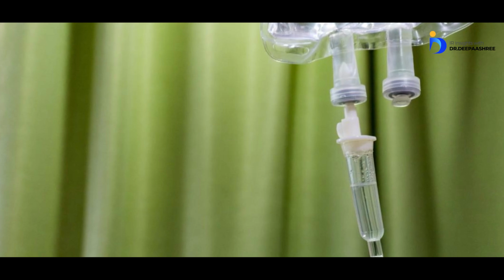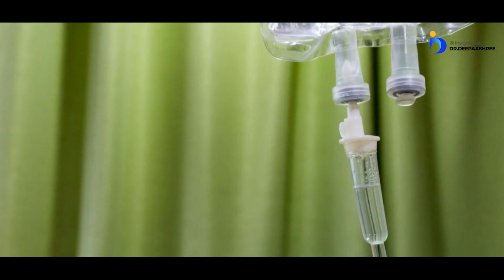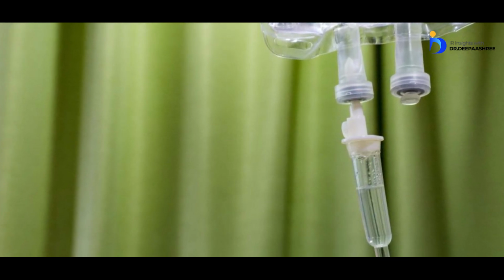Suppose you feel you need better penetration. Immediately remove the syringe, use a 3 ml dextrose syringe and push it. It will go again slowly. Now again, there is a difference in the density of dextrose and your glue. When you're injecting dextrose, inject very slowly. You will see that it will again fly off. The same thing with PVA particles: the moment you start using saline, there's a total difference in density and it will immediately fly off.